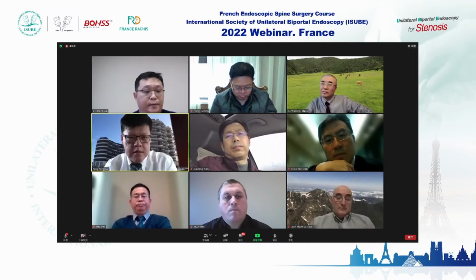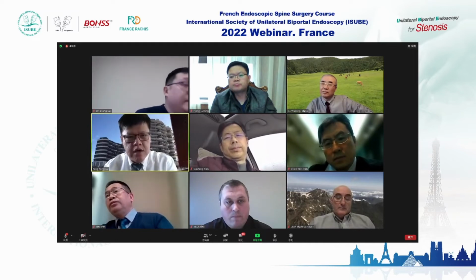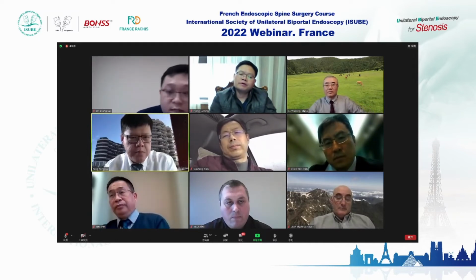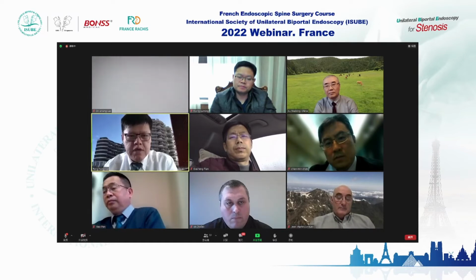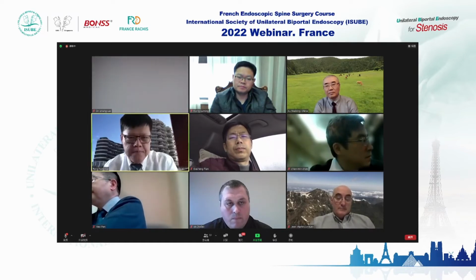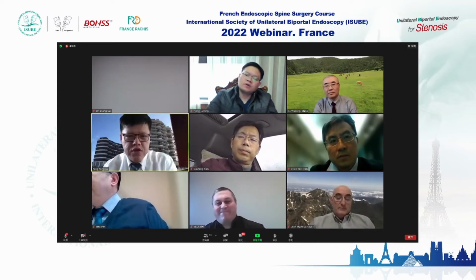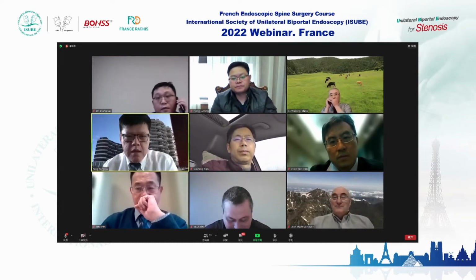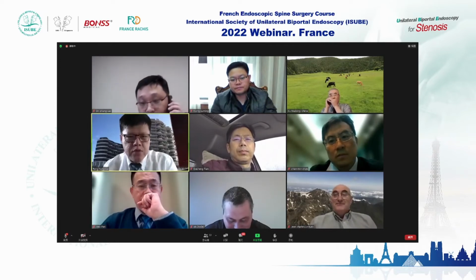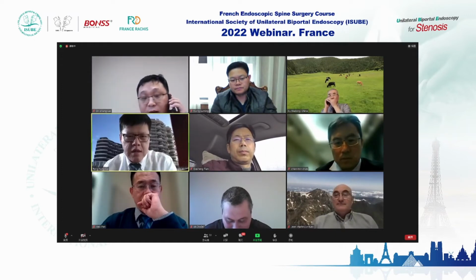One is ipsilateral direct, one is an inclinatory foraminotomy, which Dr. David Song from South Korea is proposing. There are advantages in each of the systems, and they're all effective. Uniportal tends to dock directly onto the V point and bypass all the soft tissue dissection, and hence it's quite efficient and quite fast to get to do what we want to do. But if a very good master in biportal, they can get this in 2-3 minutes, like Dr. Song showed us, so it really doesn't make any clinical difference.